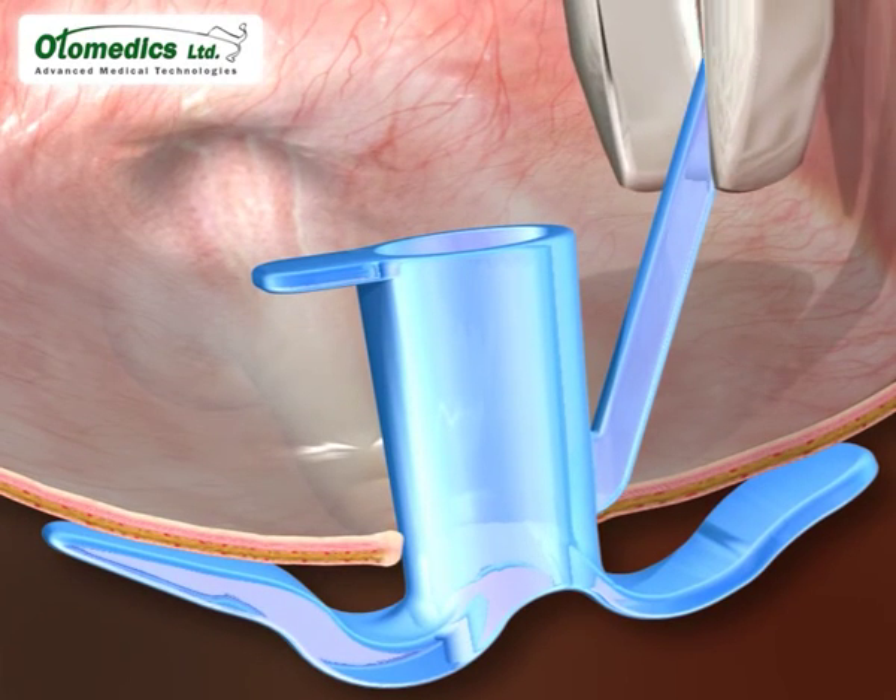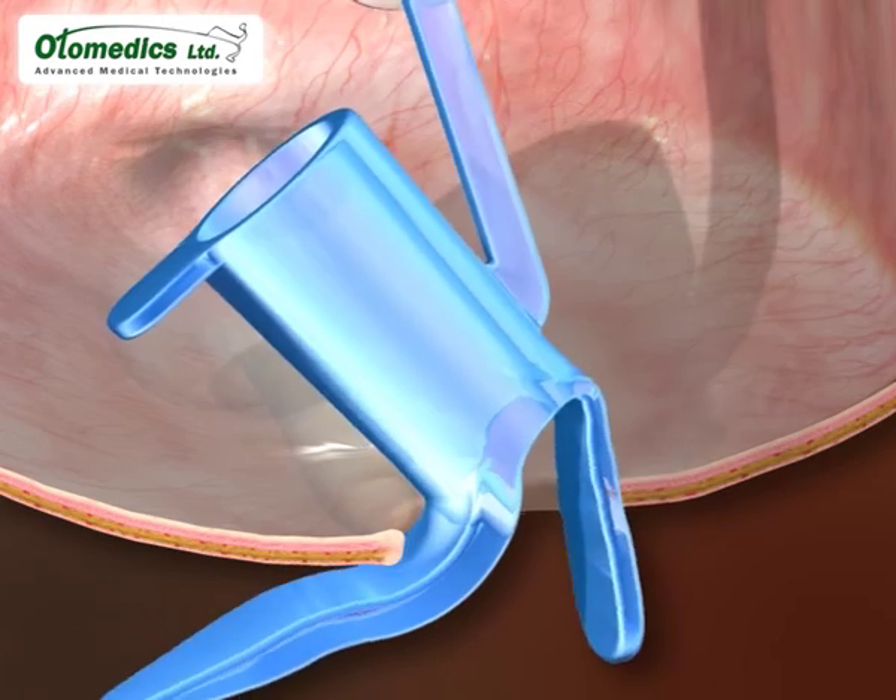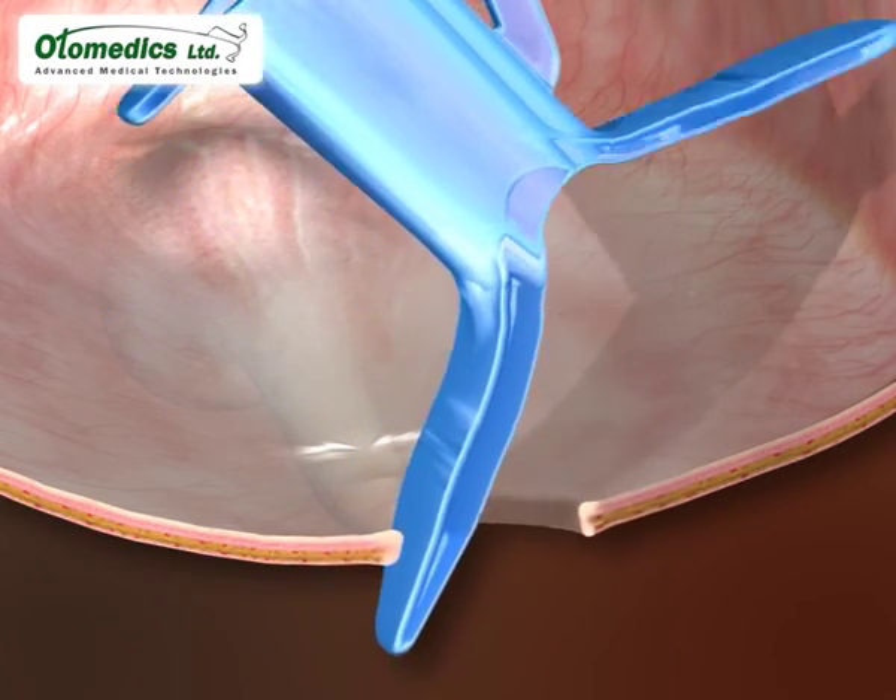When the tube has to be removed, the extraction handle is pulled gently, activating the collapse mechanism, and the tube comes out easily.